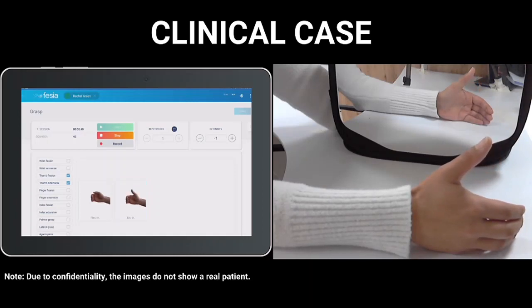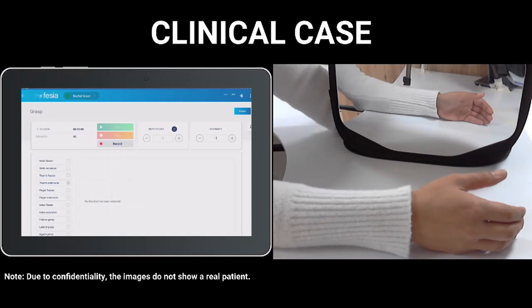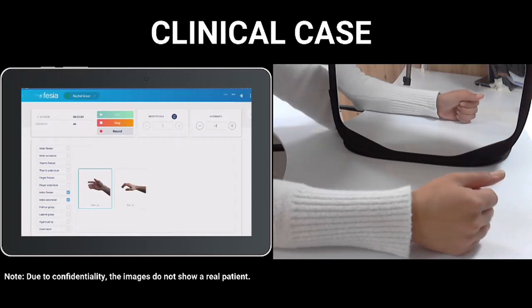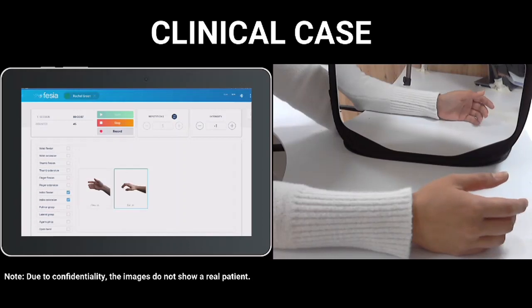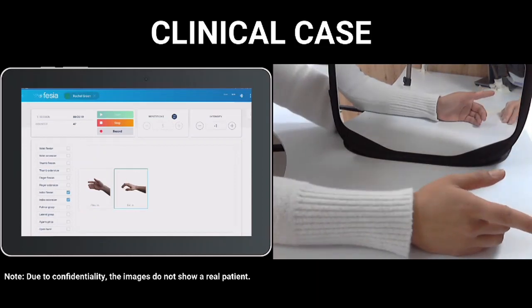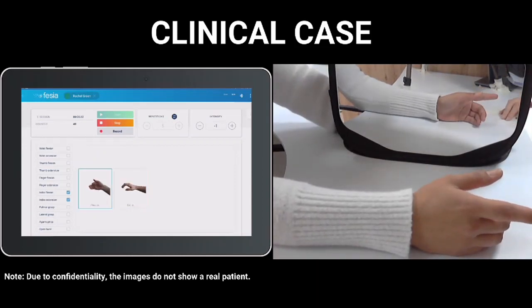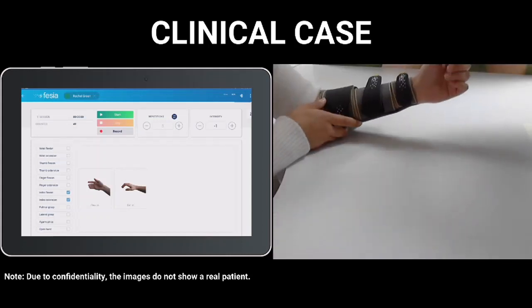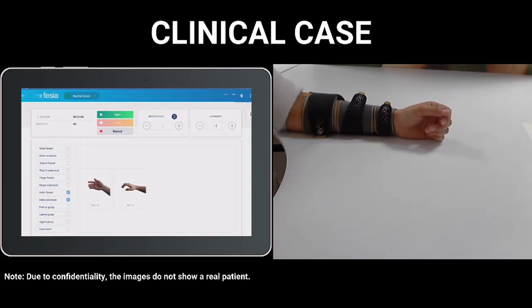Perfect. Here we are training the thumb extension, but we can do the same for the index flexion and extension, for example. Let's try these two movements. That's it. Only the index. Perfect. And this is a very interesting movement before training the pinch. Perfect. Let's retire this mirror now. And we are going to pass to a more functional exercise.